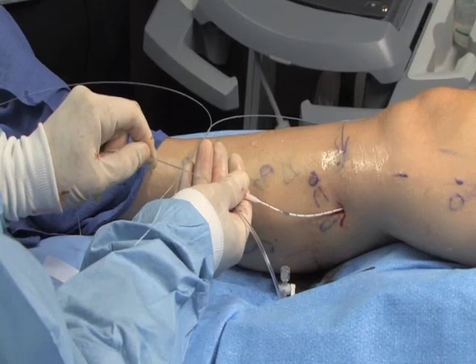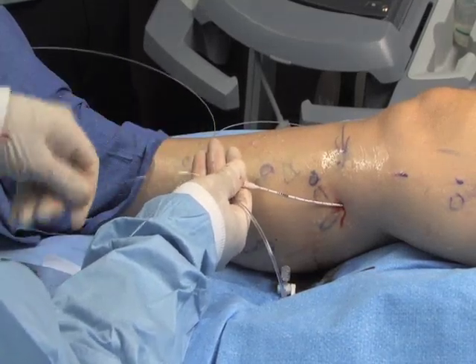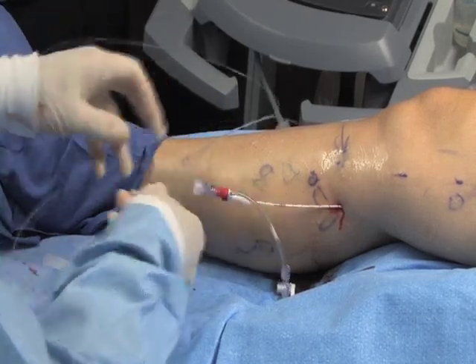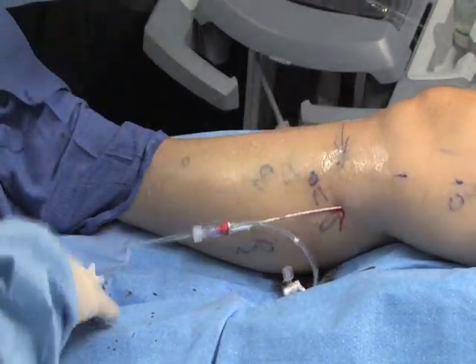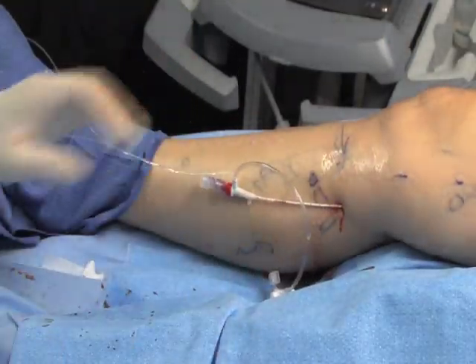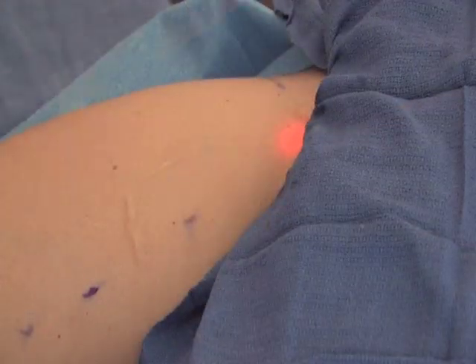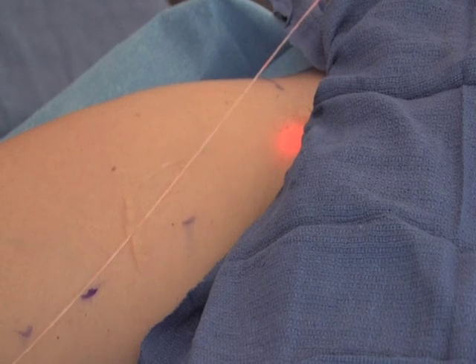Next, thread the laser fiber through the introducer sheath. The fiber has markings to ensure proper placement within the sheath. When the fiber is advanced to the first mark, its tip will be at the same level as the tip of the introducer sheath. Leaving the laser fiber in place, withdraw the introducer sheath about 2 cm, exposing the distal portion of the laser fiber. The finder beam on the laser fiber enables visualization of the tip through the skin.